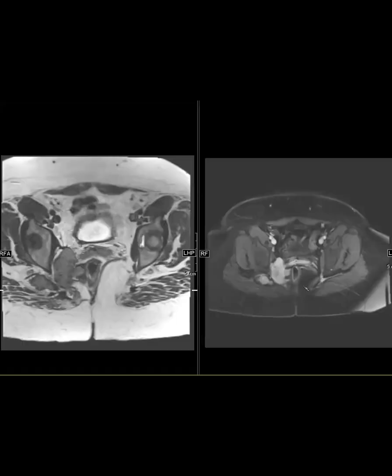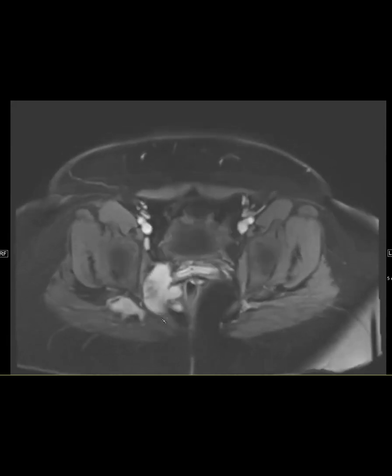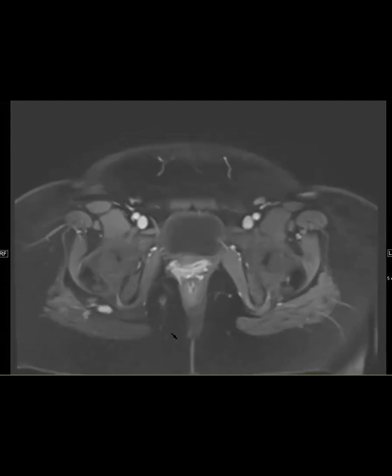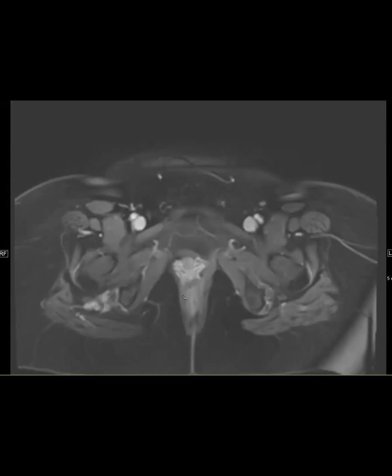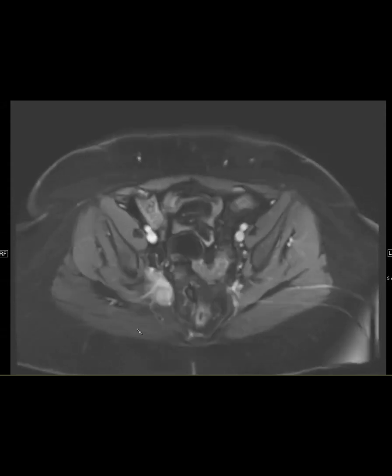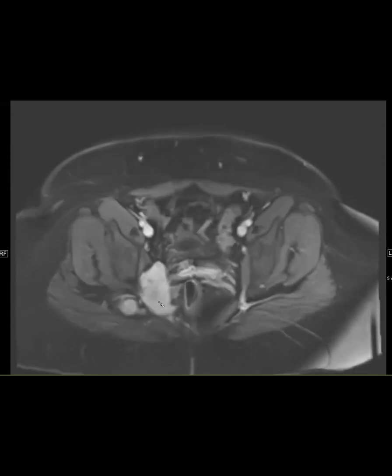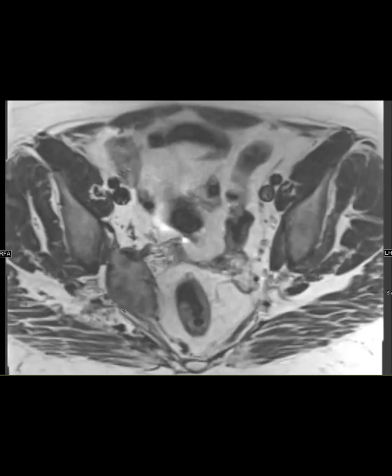And then this is the post-contrast. Fairly enhancing, growing in multiple directions. Last week, Nellie had brought up an angiomyxoma. Those tend to go more into the ischioanal fossa here, rather than through the sciatic notch. Fibromatosis. Yes, good. So that's what this was. This is also called desmoid, but the better term is aggressive fibromatosis.